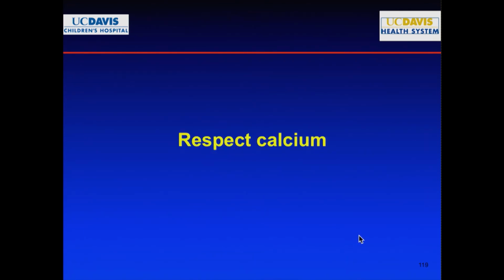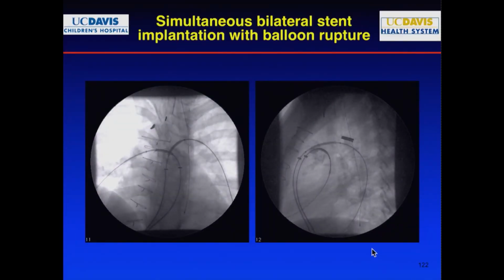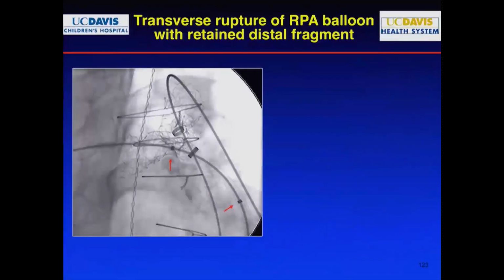All right, so respect calcium. Sorry, I'm gonna bypass this. Okay, I'm sorry. So I'm gonna get rid of this, but again, just respect calcium. Again, as I said, either you win or the calcium wins, and both you lose, no matter which way. So always pay attention to that.